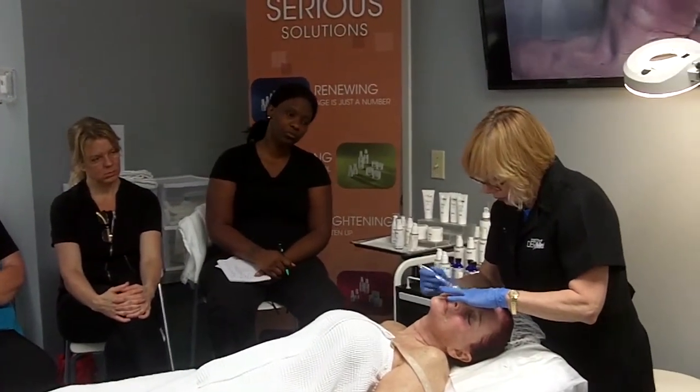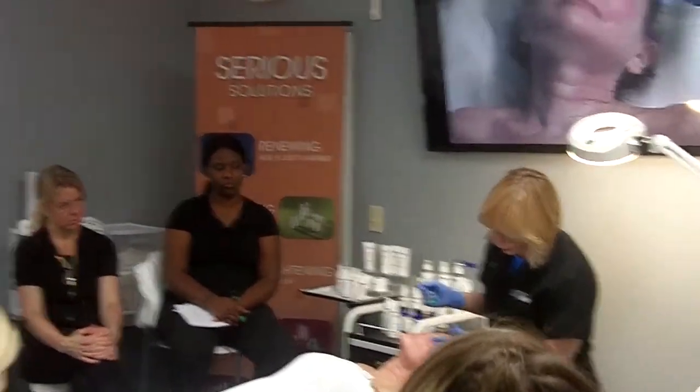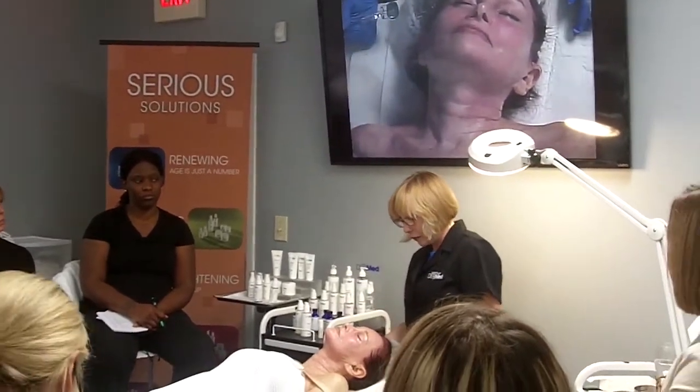What I'm really looking for out of this, because we have a nice peel on her skin, is that erythematous flush, so you can see the difference. Now, if I had a longer needle, she'd be looking like that.